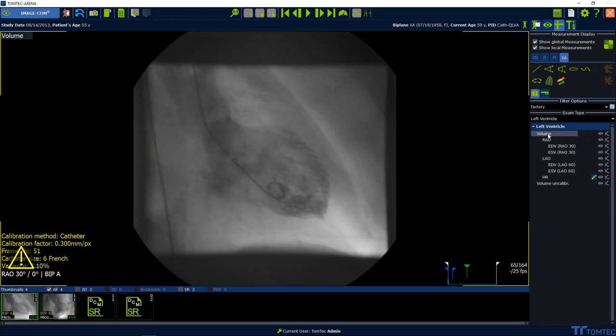Select volume in the right plane: right anterior oblique or left anterior oblique.